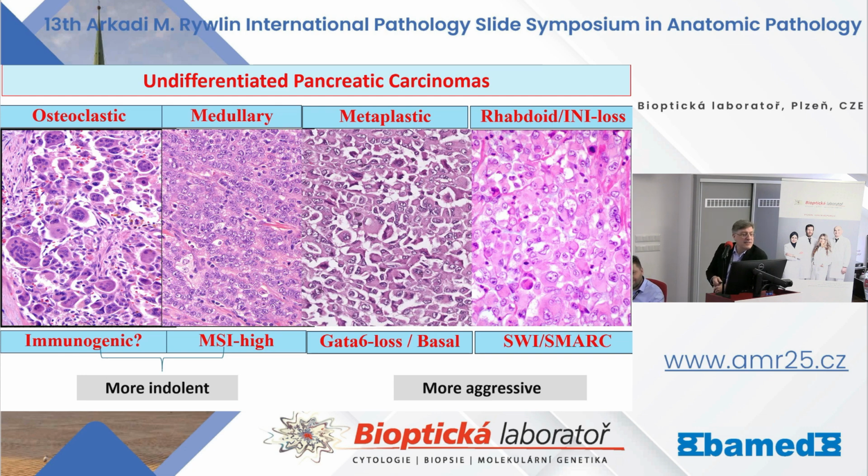So osteoclastic cells are seen in sarcomatoid undifferentiated carcinomas with osteoclasts. And these are actually better behaving tumors. Some of them are living much longer than your ordinary pancreas cancers. So it's important to distinguish the osteoclastic ones from other pleomorphic undifferentiated carcinomas that we are illustrating here.